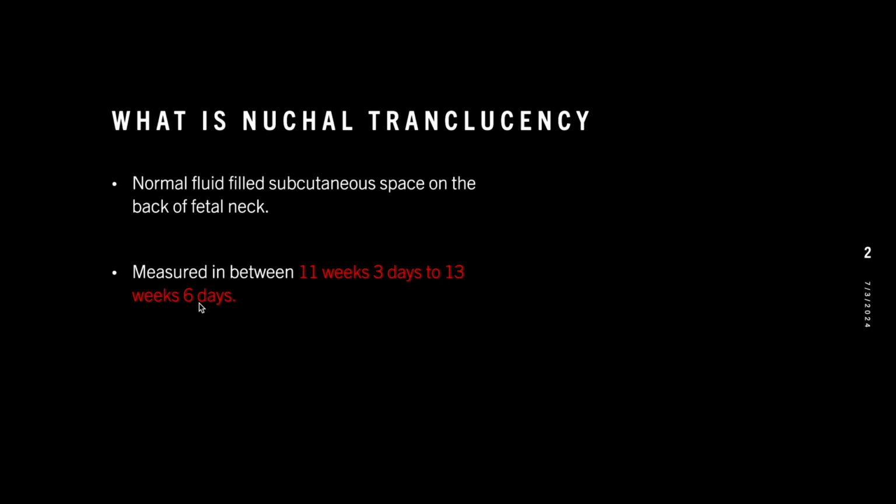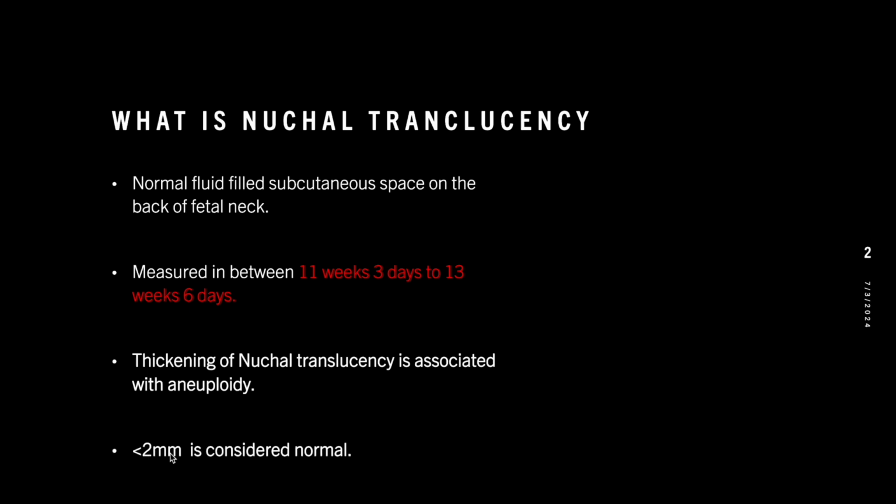So why do we actually measure nuchal translucency? Because thickening of the nuchal translucency is associated with aneuploidy. Normally, nuchal translucency is considered normal if it is less than 2 millimeters. If it is more than 2 millimeters, then we have to suspect aneuploidy.